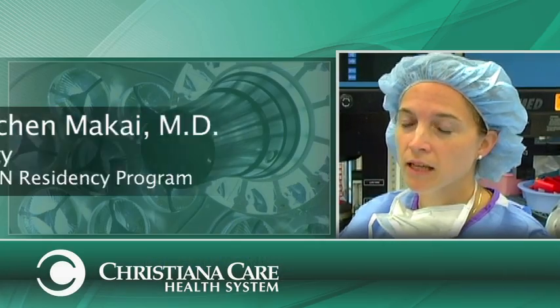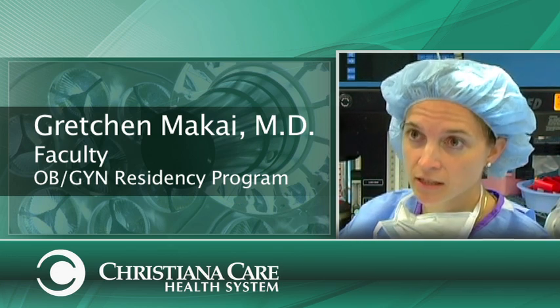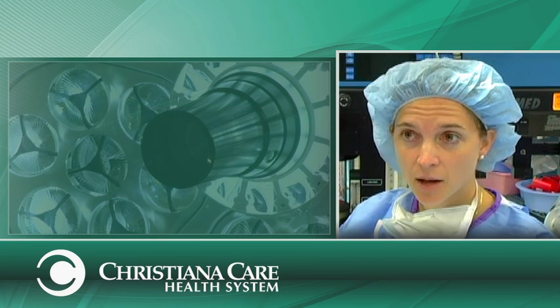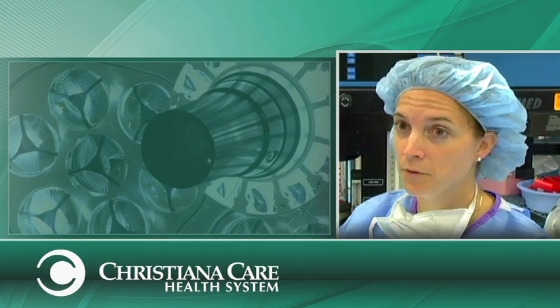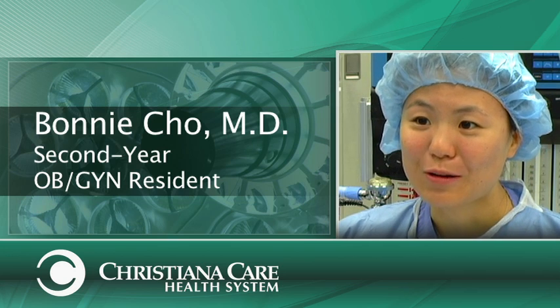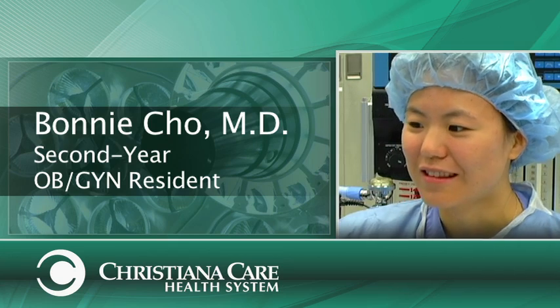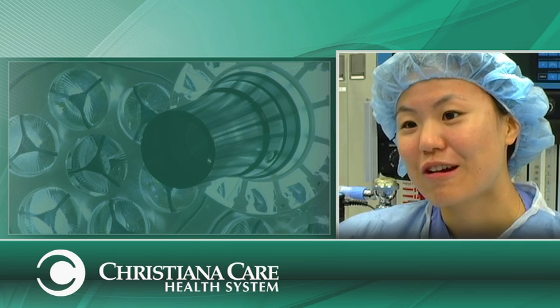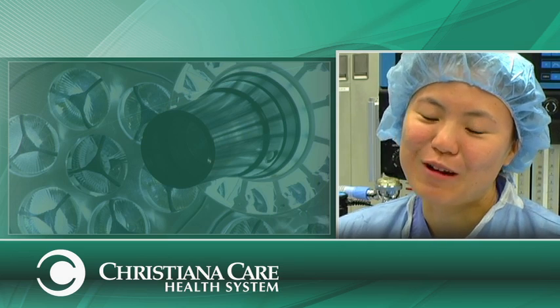For me, the most important thing we do in the simulation center is train our residents. When we train our residents in complex procedures in a simulation environment, we can preemptively discuss complications, discuss routine management, and therefore when we get into the OR, it's not the first time we've practiced these complicated procedures. In the beginning as an intern, you're just getting used to not only the instruments but the cameras, the machines, what those beeps mean — and just being able to have everything in the sim center essentially simulate what our ORs look like. It's just a great advantage.